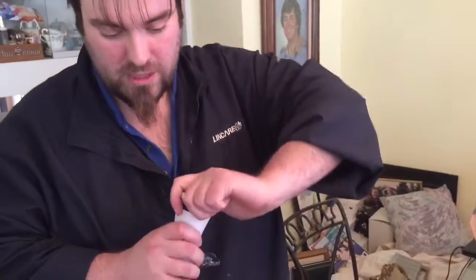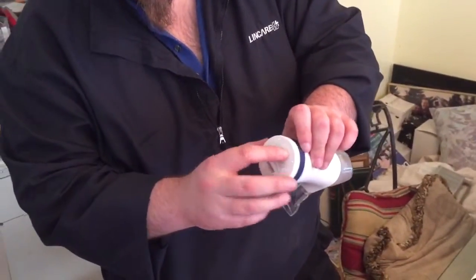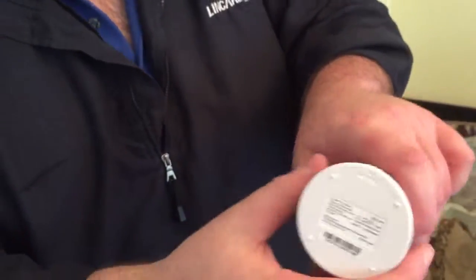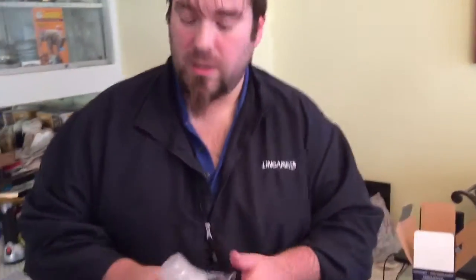It says right here: open — turn this way; lock — turn the other way. So now, say she doesn't want to use the mouthpiece, you have the masks.